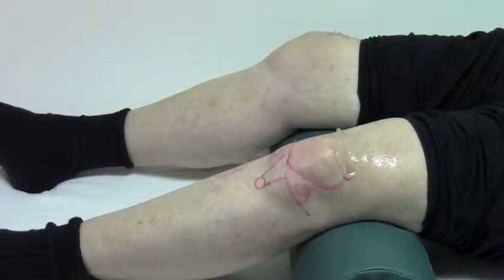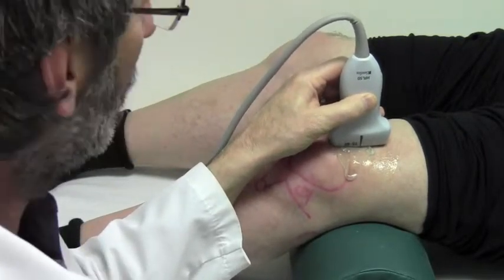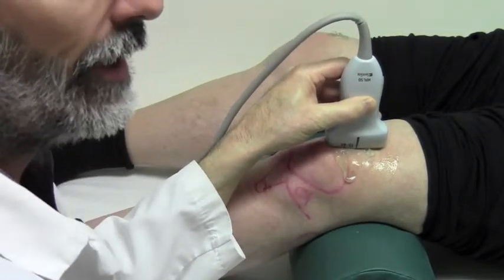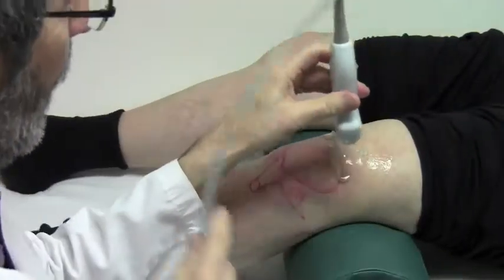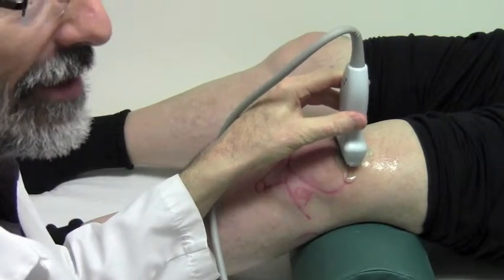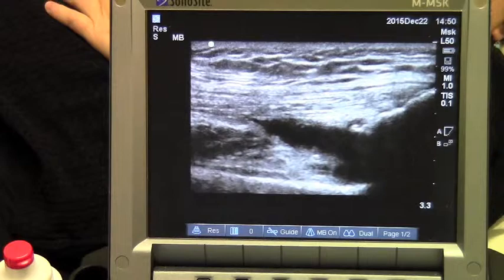This is Shirley's left knee and we're going to take a look at it under ultrasound. I have a portable musculoskeletal ultrasound, and looking at her knee joint I can see she has a very small joint effusion, which means there's some fluid around the knee joint. I can change the angle 90 degrees and see the fluid collection from a different angle. This is what her knee joint effusion looks like under ultrasound.